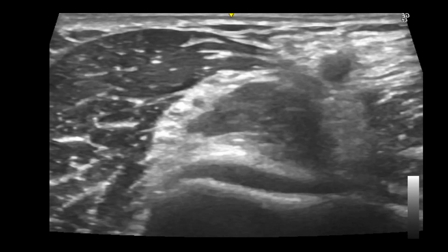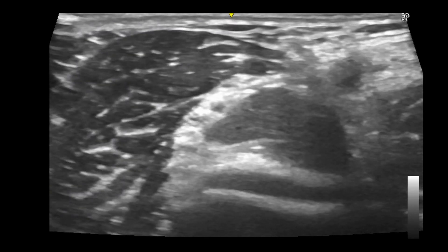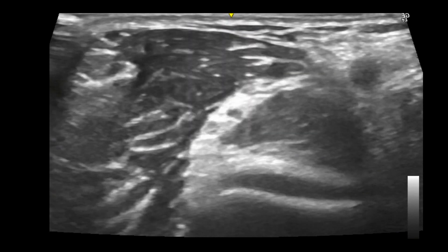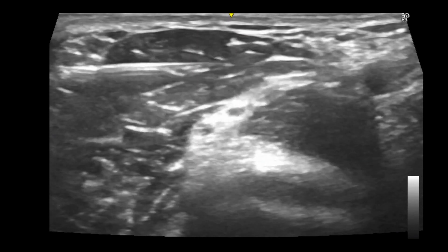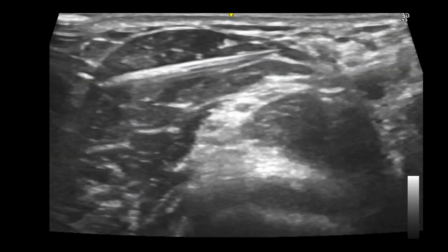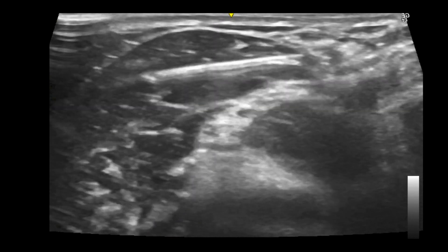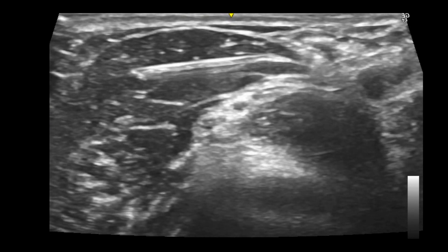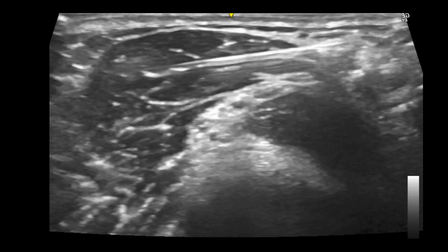You can see here a view of the antecubital fossa. You can see a needle being inserted from the lateral aspect, approaching the area just below the cephalic vein. As it pops through into that area, you can see the cephalic vein, and a small amount of local anesthetic is going to be injected heading towards the lateral antebrachial cutaneous nerve.